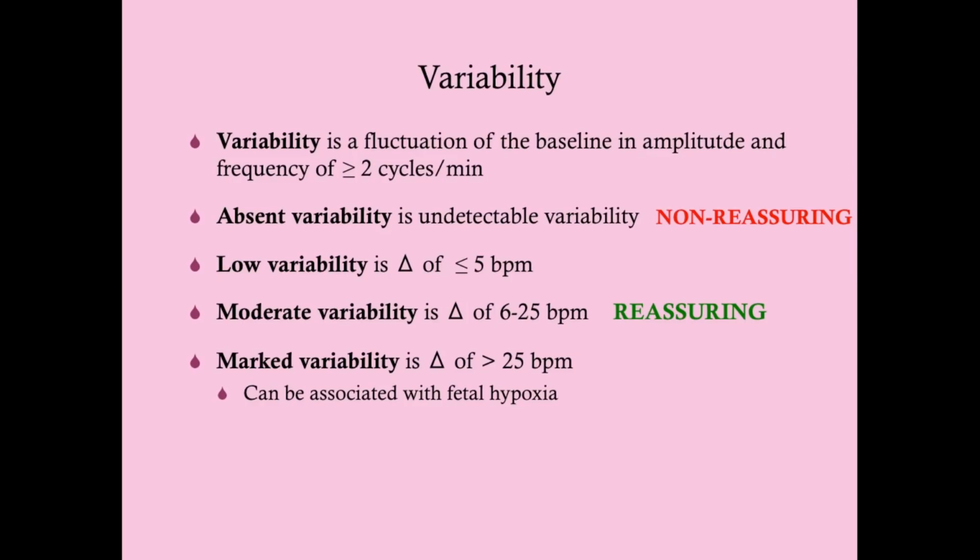And so for that reason, a lot of times when we see absent or very low variability, the baby tends to be bradycardic. So these are things like CNS depressants, morphine, Demerol, Stadol, alcohol, things that mom might take. In baby, it can be when they're sleeping. Parasympathetic nervous system is really going to be kicked in during sleep. CNS anomalies like anencephaly, hydrocephaly, hypoxia, cardiac anomalies, etc. So typically we tend to see reduced variability when you're either bradycardic or tachycardic. Just kind of a rough rule of thumb.